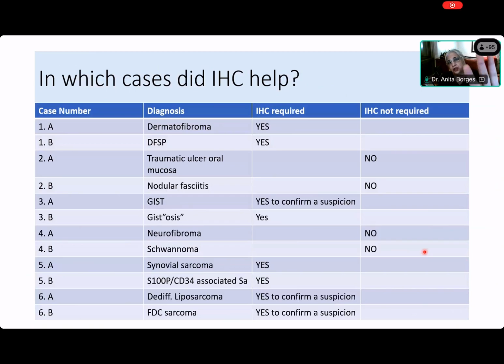Okay. Now, I just want to show you, we saw so many of these tumors. I just wanted to tell you that immunohistochemistry was not required in these cases, in the ulcer, in the nodular fasciitis, in the neurofibroma, in the schwannoma. Okay. Synovial sarcoma, yes, you need that immunohistochemistry. And the reason I say this is that synovial sarcoma today can be treated in a relatively specific way. So if you can call something a monophasic synovial sarcoma, if it's biphasic, the diagnosis is easy. Monophasic, you must do it. And of course, this we would not be able to diagnose unless we had these two.